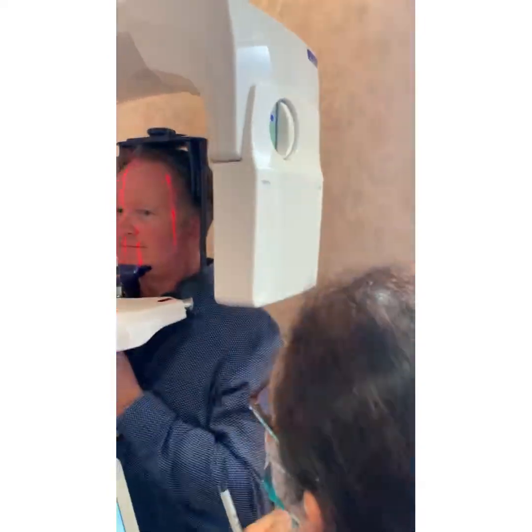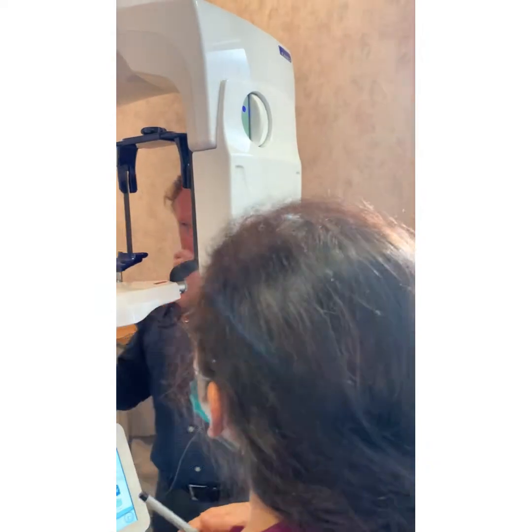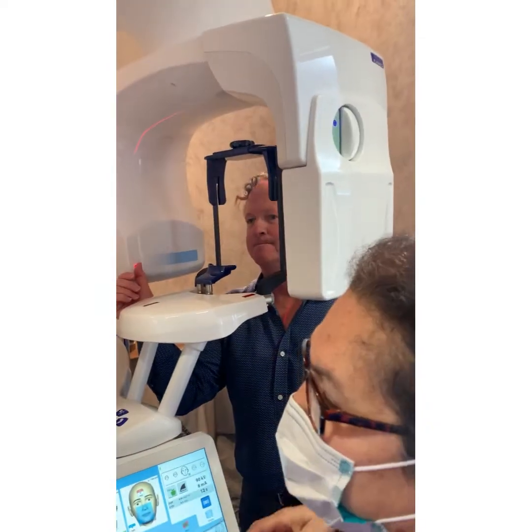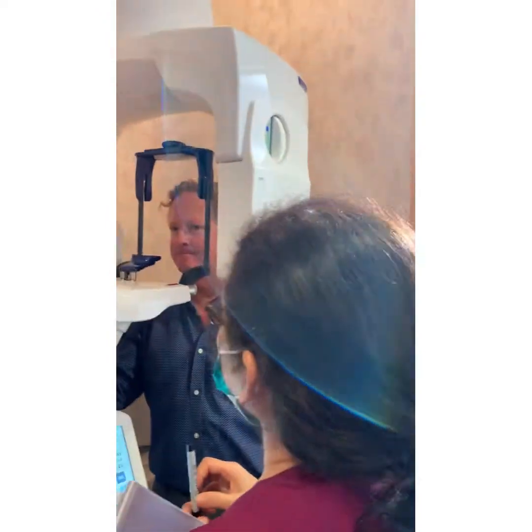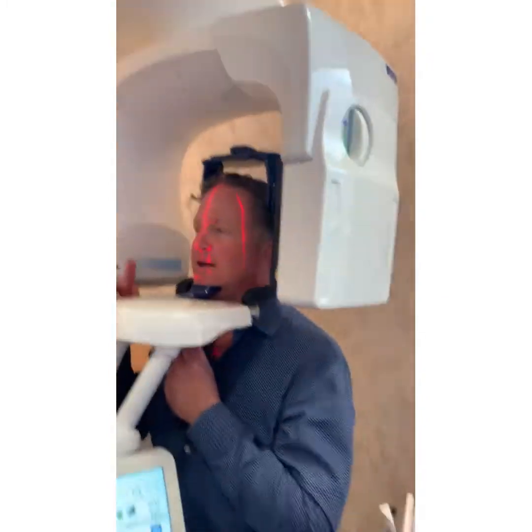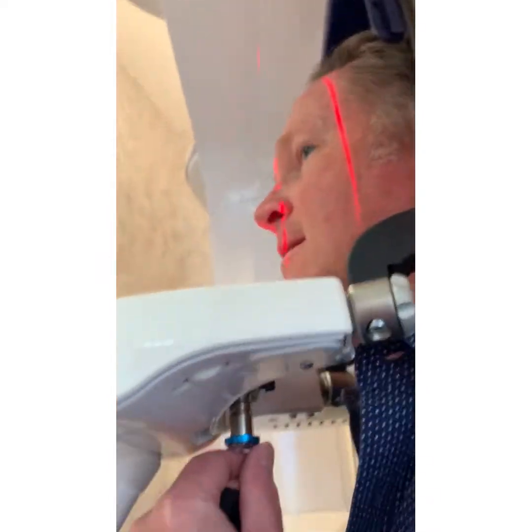No. Lift up right there. Okay, but why would you lift that up instead of just bringing the line down? Did you want it under your jaw? Because you can't adjust this line, you can only adjust the patient to the line. No matter if you go up or down, you're just moving the whole thing up, and then their head's gonna go up with it, moving where the volume is. If you move the chin thing down, the line stays the same. It's just your focus is now smaller. It's lower.